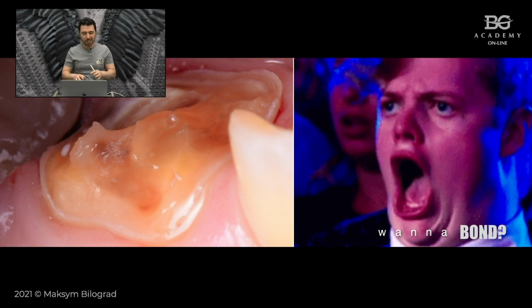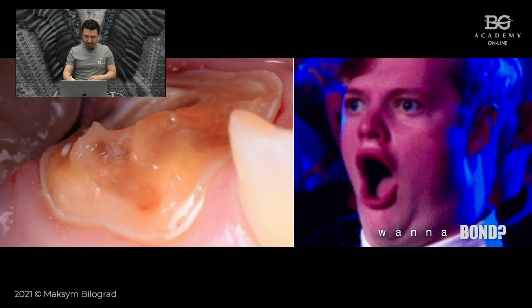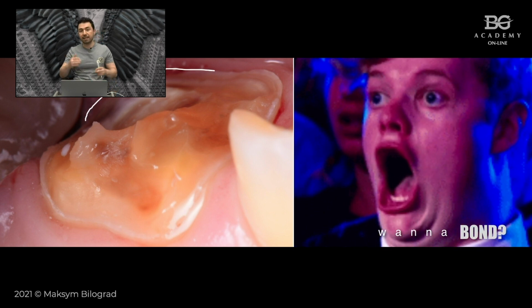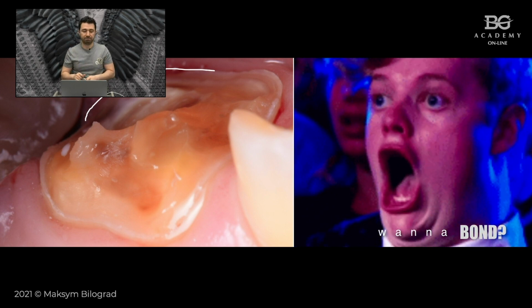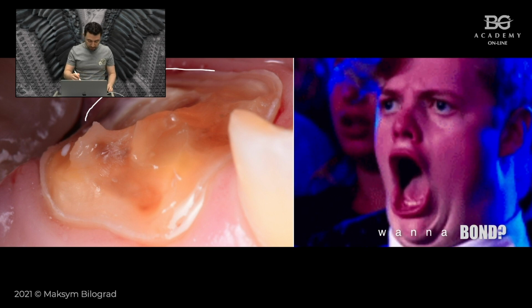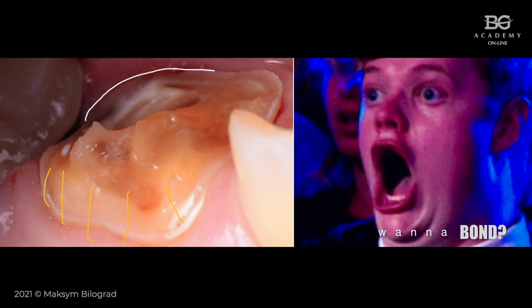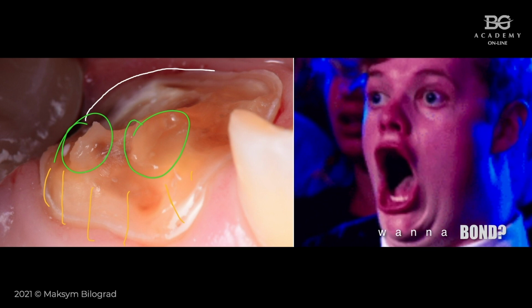I was shocked because the tooth is still vital, and from the lingual side you can see the level of the tooth is below the gum, and there is no ferrule effect here, nothing, zero. From the buccal side we can have some small supragingival areas, maybe some small stalactites also, but the rest is as you can see.